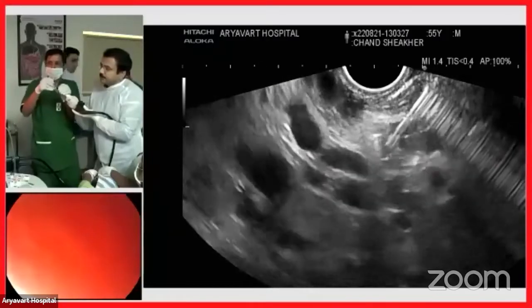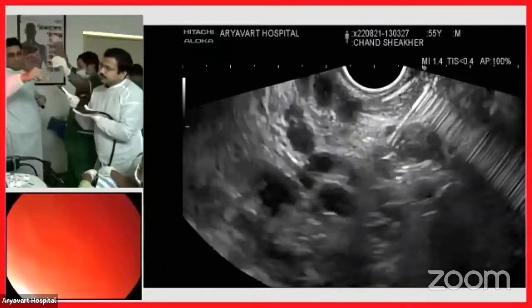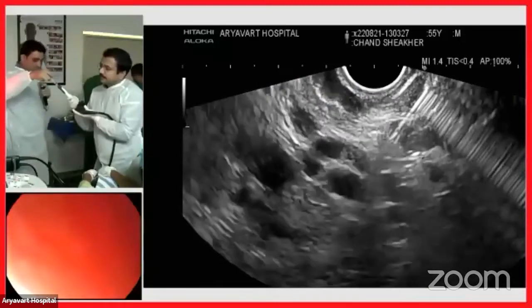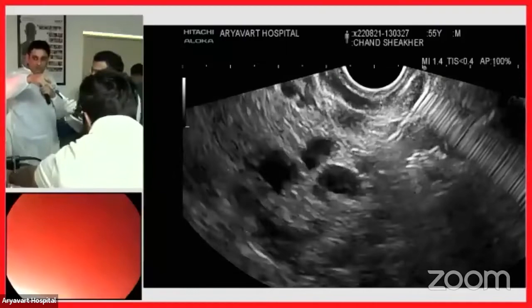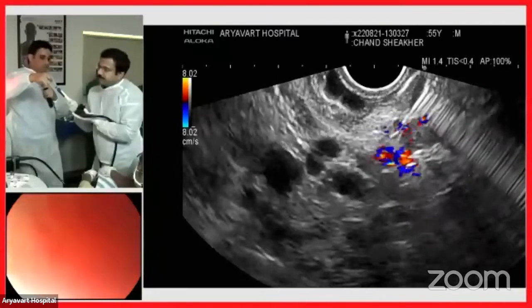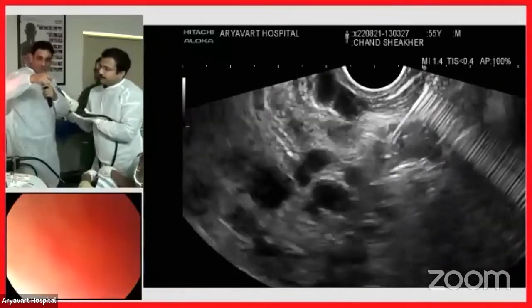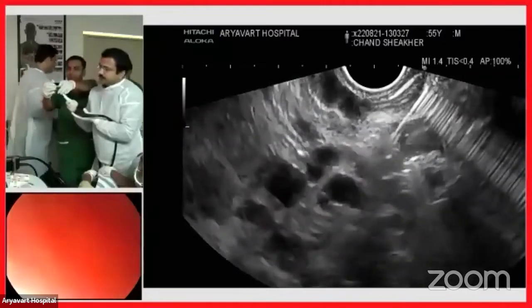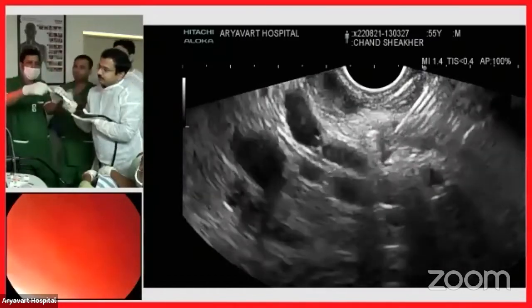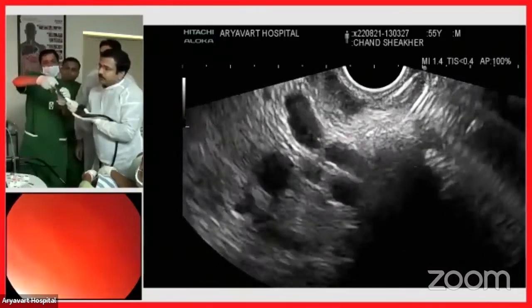Now we flush again and use Doppler to check how much flow has been blocked. You can see almost a significant amount of flow has decreased. Now, do we need any more coils? Let us assess and then push the glue. One coil has already gone in. Now we are injecting glue — be very fast with the glue. We have injected around 2 mL of glue, and you can see the snowstorm appearance.